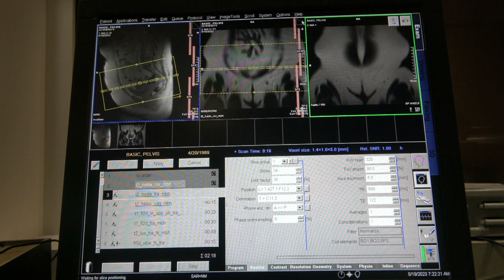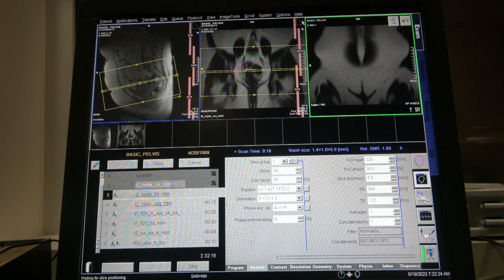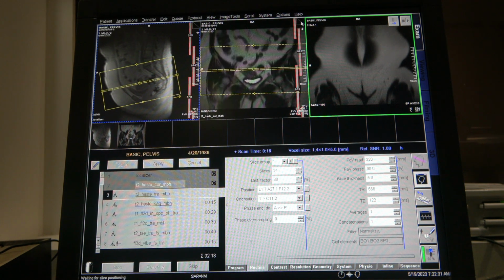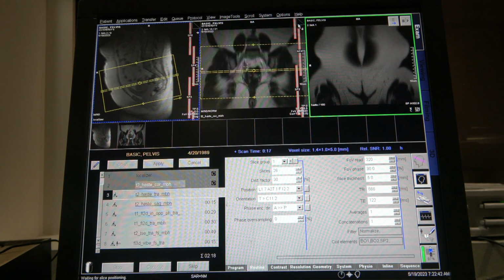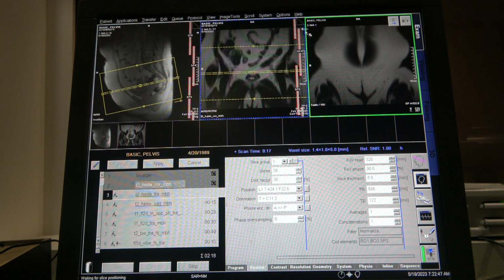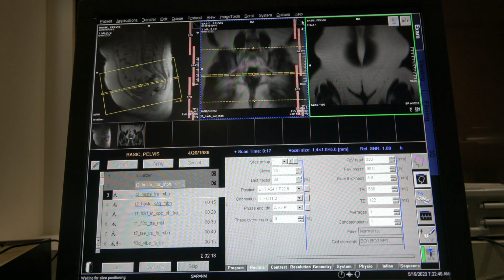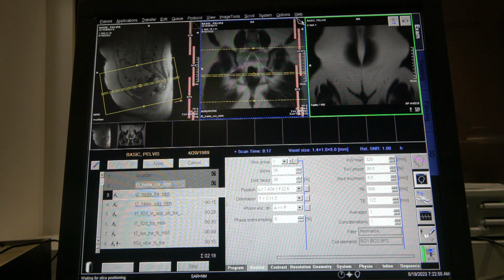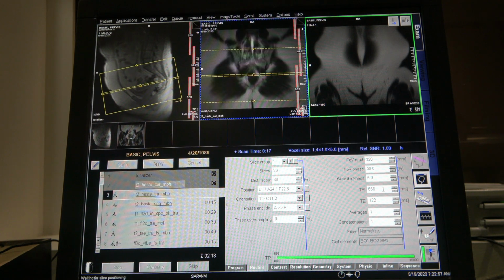So here we are. Remember, we just care about bladder, uterus, ovaries. Okay. Because it's a female pelvis. Okay. Remember my motto: more is better than less. All right. That looks pretty good. Looks like we're getting everything.